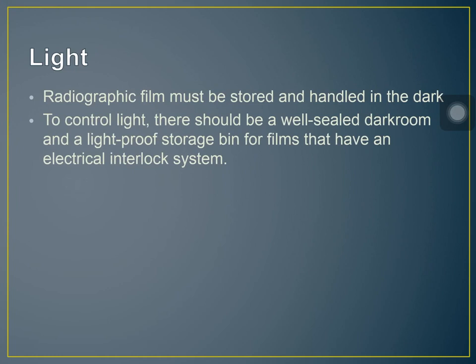Once there's a light open or the door of your dark room is open, the bin won't open. Kasi naka-electrical interlock system siya. Kapag may madedetect na may liwanag, hindi mag-open yung storage bin ninyo. Okay? So, if low level, diffuse light exposes the film, fog is increased. Low level lang to ha. Yung parang pasulyap sa liwanag ang nangyari. Ang mangyayari, there will be an increased light fog.